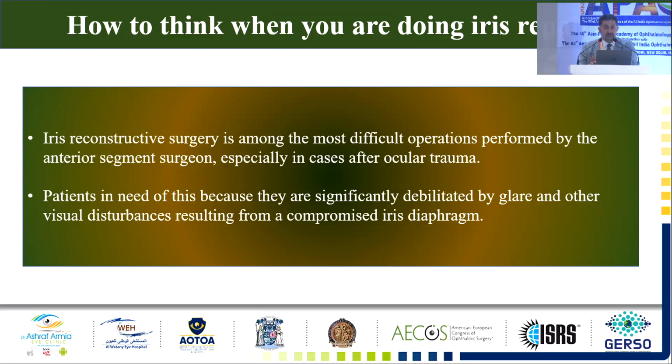When we think about iris repair in these situations, you are going to reconstruct the pupil as much as you can to maintain the pupil size. Either we go for pinhole pupilloplasty, as Ammar innovated with his group, or you do the through-and-through pupilloplasty, which in my hands over the last 5 years has been the easiest way of iris repair nowadays.